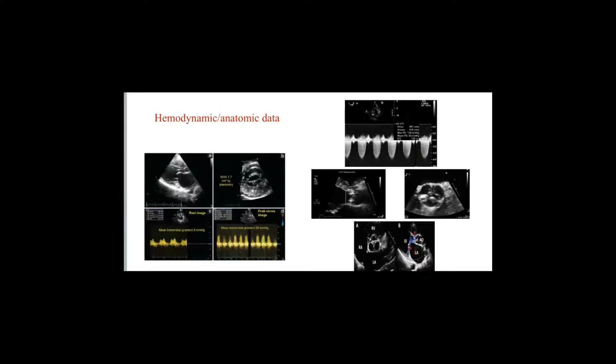And this is so important in echo, to the extent that you can be so ready to dismiss any significant hemodynamic data if the anatomy is not consistent. For example, if you elicit grade 3 diastolic dysfunction, the patient had normal ejection fraction, had no LVH, the left atrium is normal in size and volume, there is a problem.